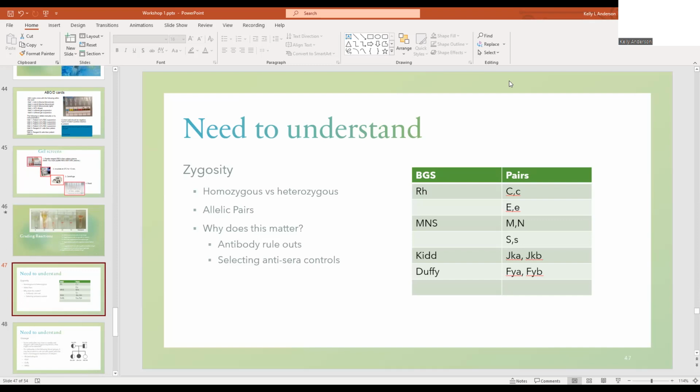So it's anti-A, anti-B, anti-D, and then control. The control is just controlling for spontaneous agglutination in your patient cells. That is why it's called a D control. That's kind of an old thing though, not really a D control when you get to AB. If your patient is AB positive, you need to have a control to make sure that the patient is not just spontaneously agglutinating.